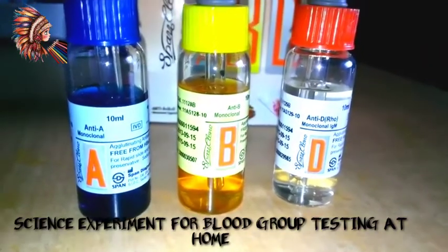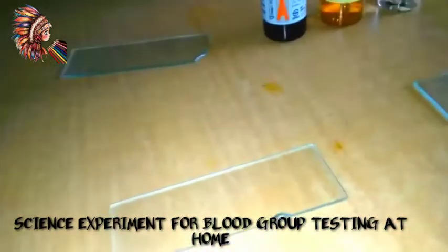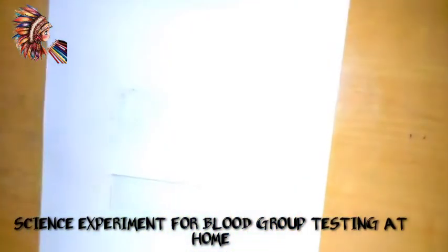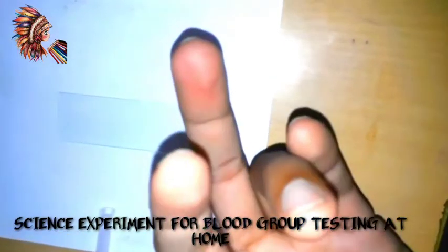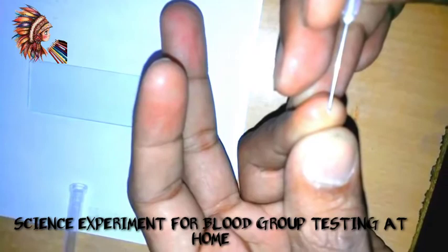Hi friends, today I will show you how you can see your blood group at home. These are three monoclonal antibodies: Anti-A, Anti-B, and Anti-D. First of all, you need to make a prick on your finger — this is my finger.